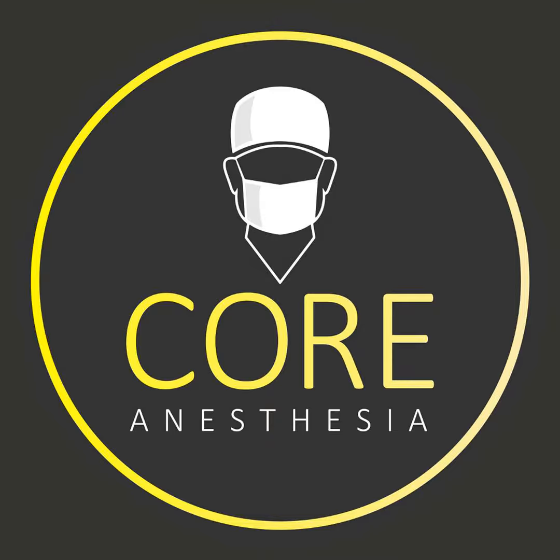So I'm probably going to step down just a touch lower and then go at an upward angle to achieve my actual spinal or my epidural. There's lots of reasons that we're numbing the skin. It's nice for the patient, but you can also use this for your own benefit as you're trying to identify landmarks and understand the anatomy of their back. And as Tanner mentioned, this part is so key to take your time on.